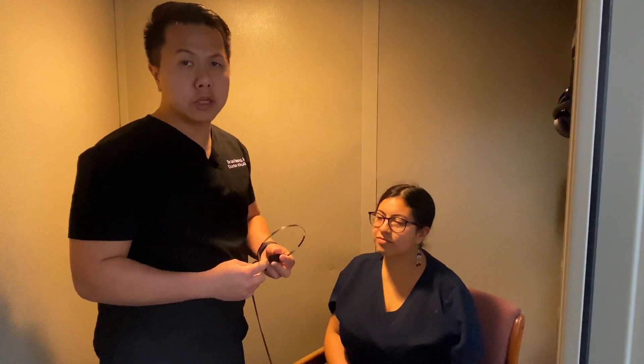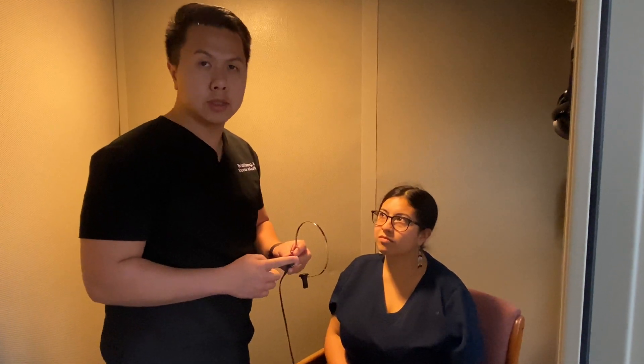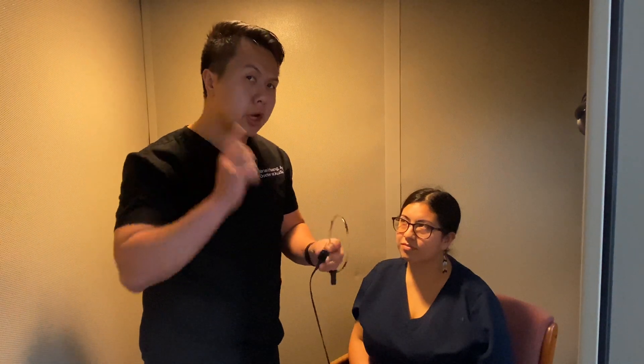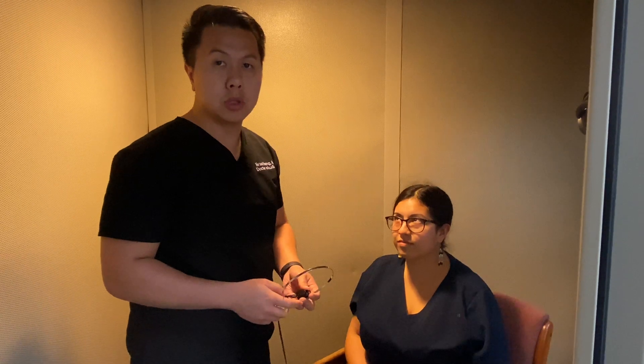Depending on whether your hearing test is going to be a diagnostic one or not, the audiologist may ask you to do bone conduction testing as well, in which he or she may put a bone conductor behind your ear in order to do the pure tone testing again, which is the beeping tone test that we saw earlier.